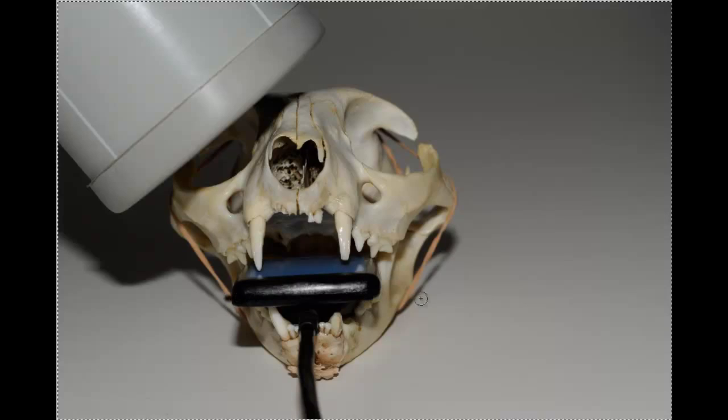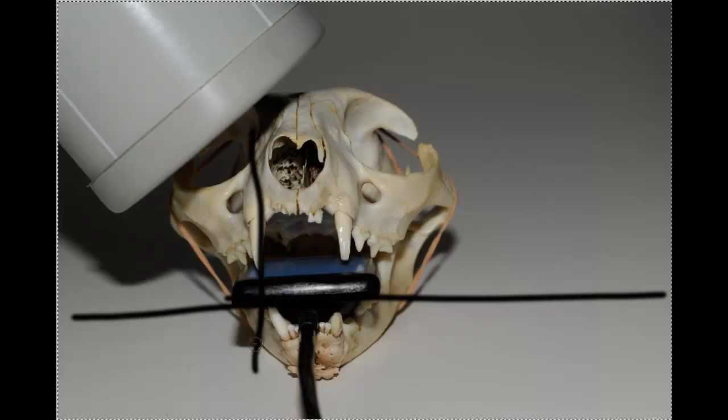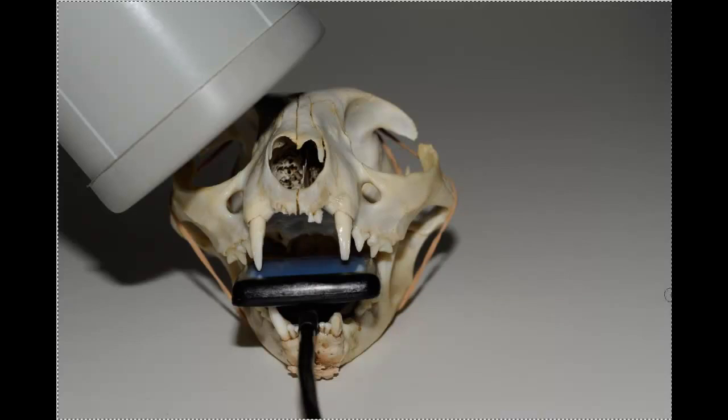We have pretty much the same angles here. In this case, horizontal sensor, vertical teeth, and a bisect, which is right about like so. Pretty much a classic 45 degree bisect.